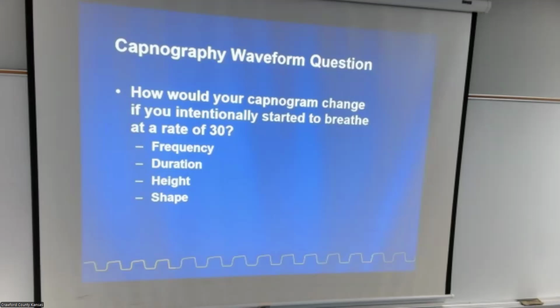If your patient is sitting back and talking to you, saying, "I started having problems breathing today, it started about 8 o'clock, and it's gotten harder over time," and they talk in long sentences for you, and their EtCO2 comes back at 52, it's probably normal for them. If you go up to them and they're struggling, and their CO2 is 52, it's probably not normal for them.